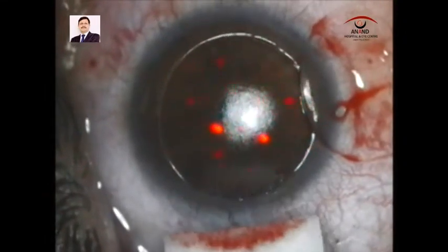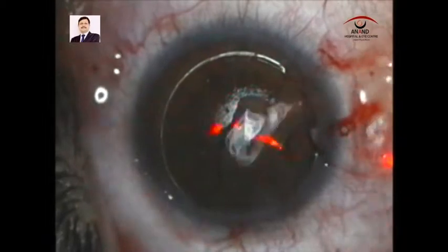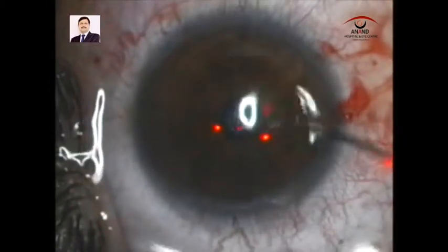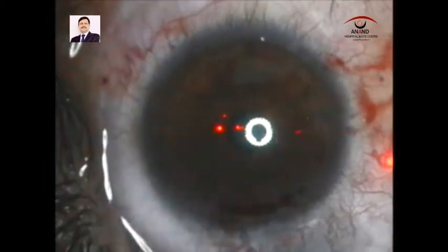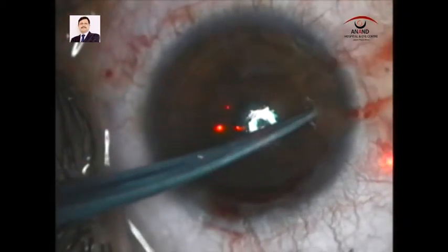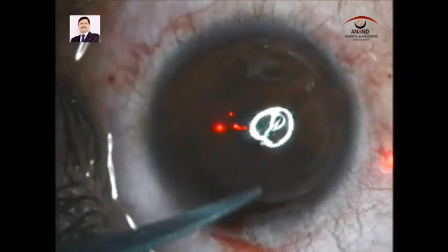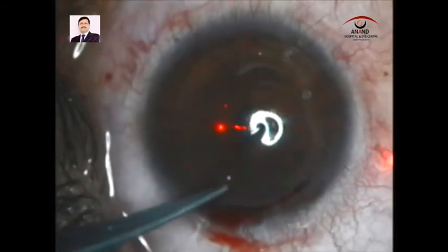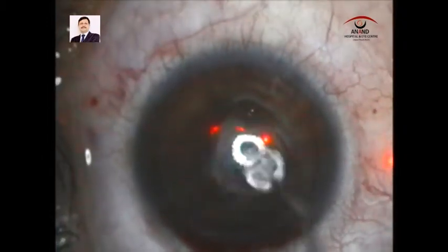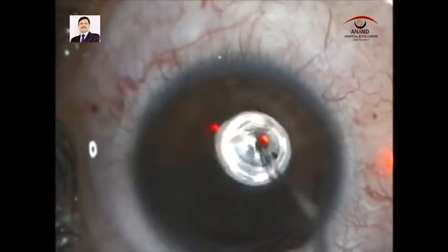The patient still remains uncooperative, but after washing the bed we gradually pull the flap back to its position, keeping the orientation of the flap in mind. We then think of using the double sponge technique to dry and reposition the flap.